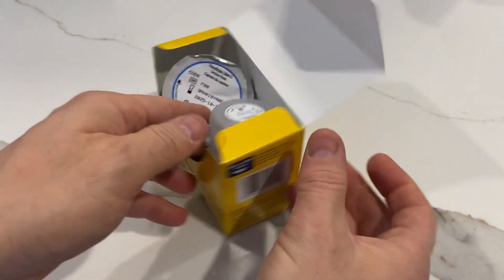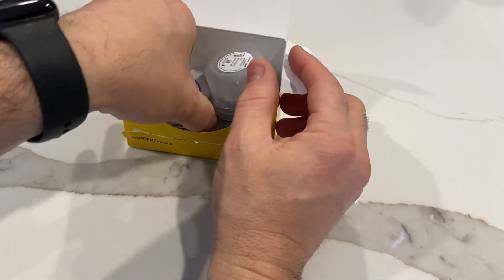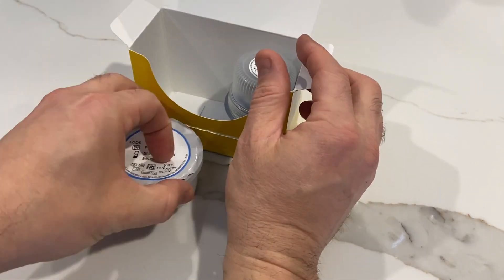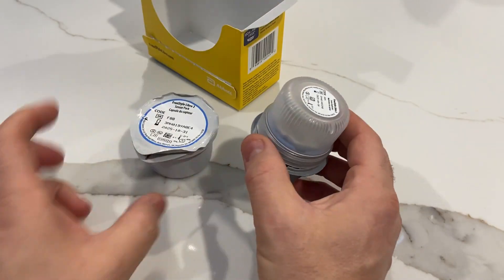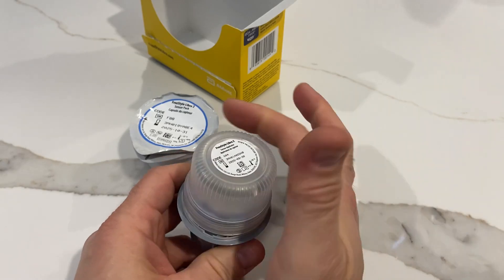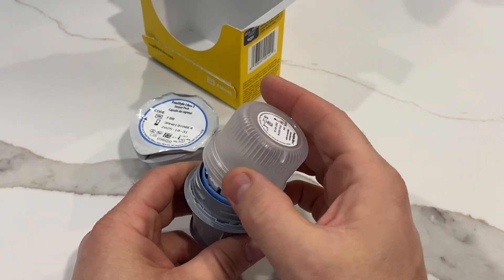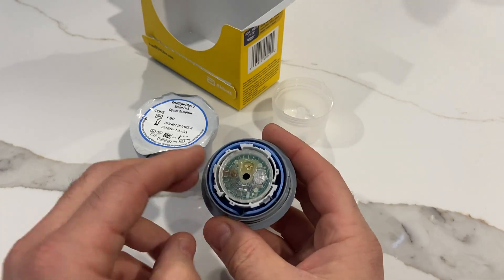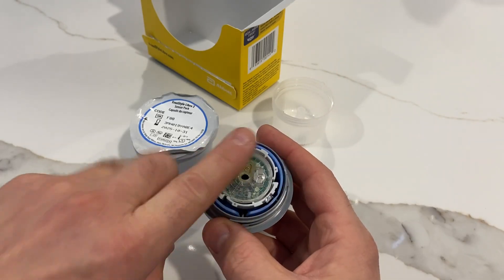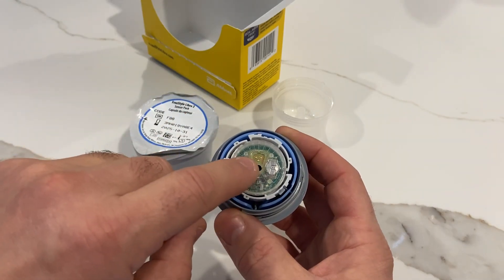I just want to show you the delivery system — this has already been used, but I can show you how it works. There are two components. The sensor is actually on this thing. Apparently they're matched with some kind of code here, not sure why, but they're matched up. This is normally covered with a sticky film, because that's the sensor right here. We're going to look into that later.